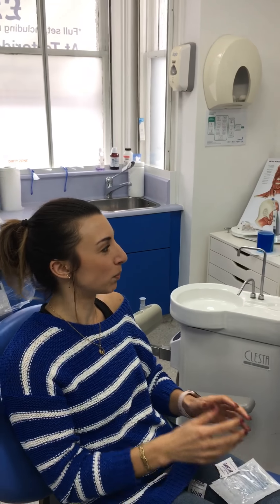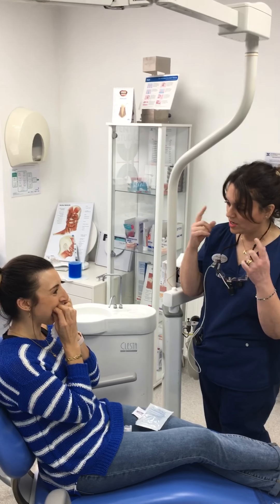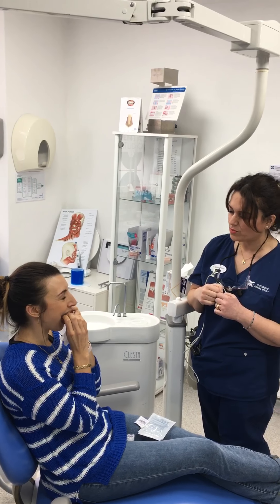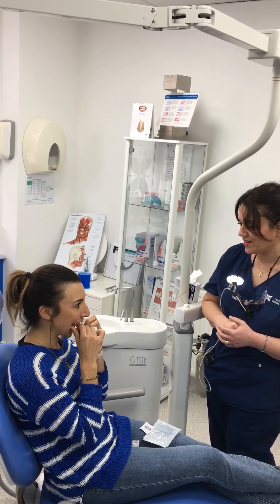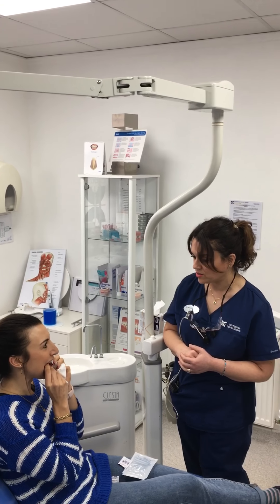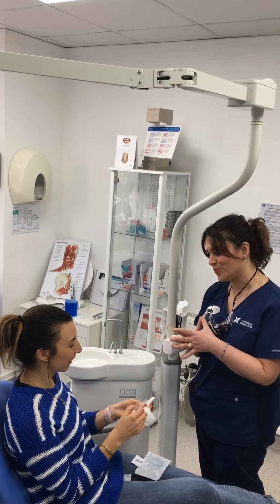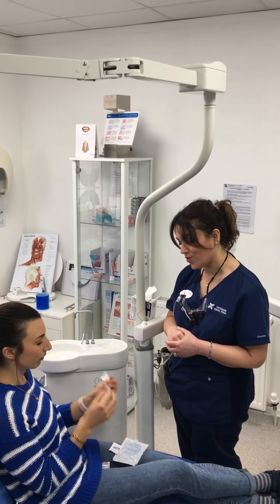How does it feel? [Patient]: It feels a bit weird. Obviously I sound different but I'm sure I'll get used to it. [Dentist]: Do you want to try taking them out? The technique is to release from the back, because the back has no attachments, then when it comes to the front — well done, fantastic! Towards the end of the week it gets easier to take them out because they get looser as the teeth move.